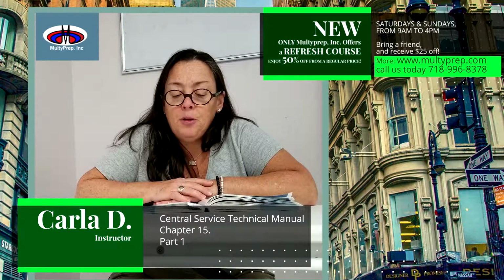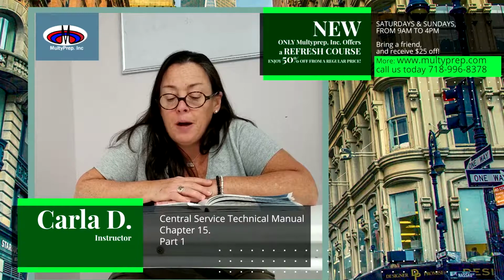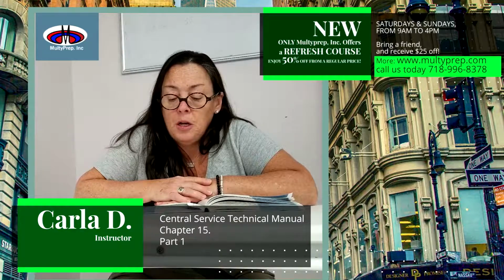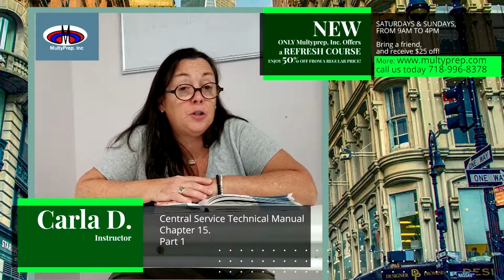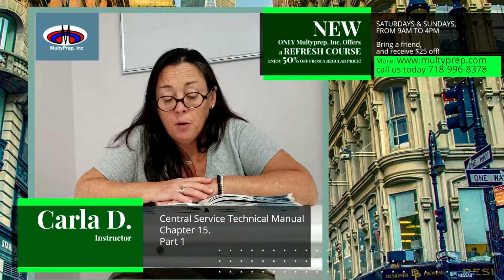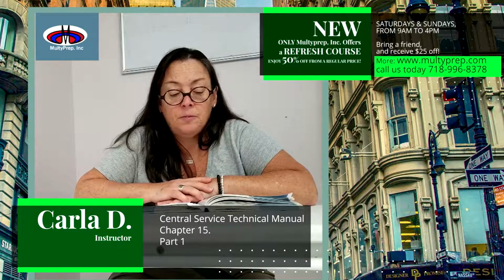ETO should not be used to sterilize the following: liquids. ETO will combine with liquids and may produce harmful chemical byproducts. Devices with energy sources. Energy sources could create a spark in the sterilization chamber during the sterilization cycle. And finally, leather items. Chemicals used in the tanning process will combine with the ETO to form chlorohydrin, which can cause negative health effects. End of chapter 15, part 1.